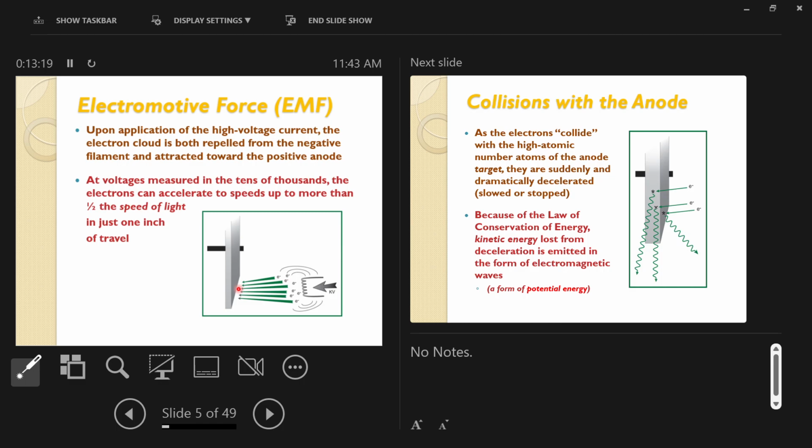How small is the gap? About an inch, a centimeter or two, something like that, yeah. You can look up inside of an X-ray tube and you can sometimes see that gap if the tube is positioned right. But yeah, it's not very far. It's macroscopic though. It's a big distance for the electrons to travel, but for you, it's that far.